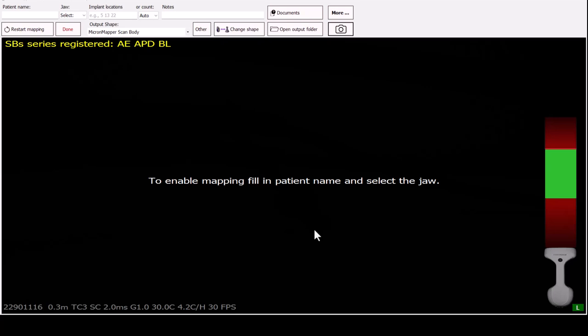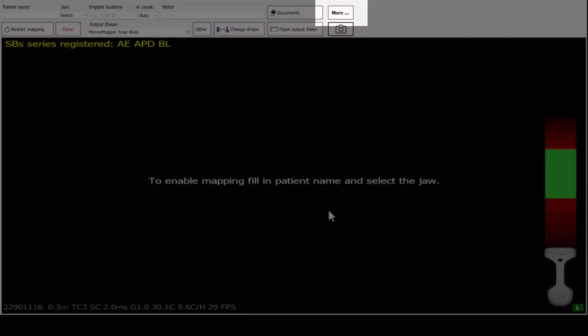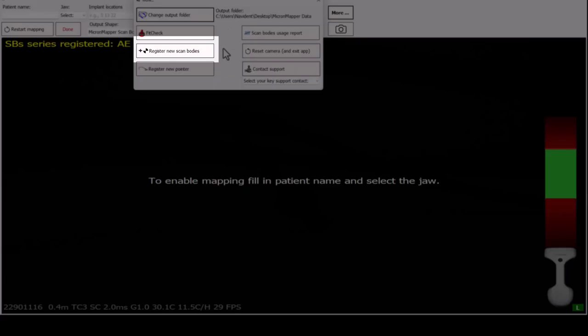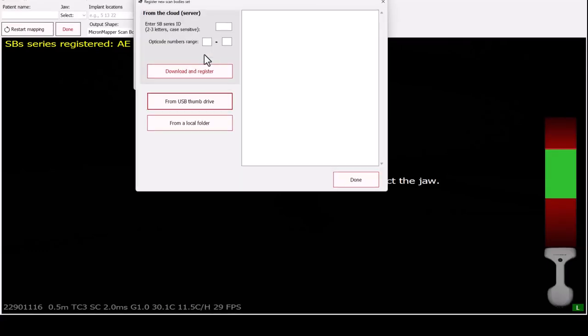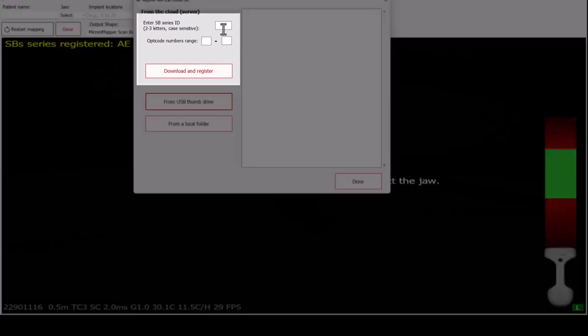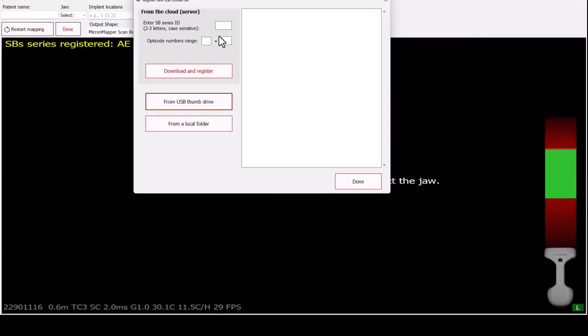Before you begin mapping, scan bodies need to be registered. To do so, click More and select Register New Scan Bodies. You will be prompted to enter the unique code of your scan flags that consists of a few letters and numbers. Please enter accordingly and press Done.